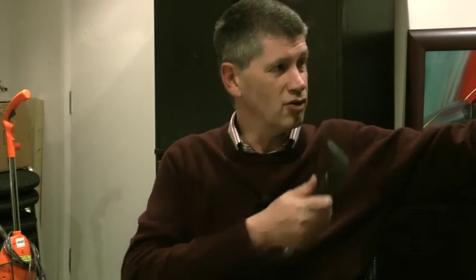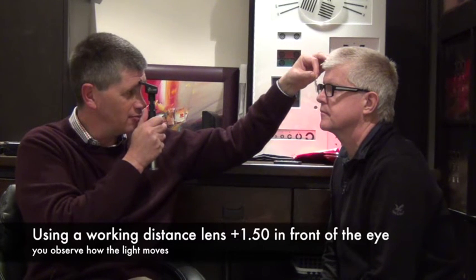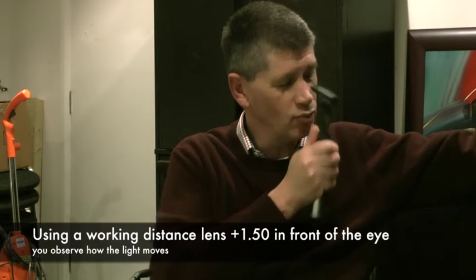To perform retinoscopy, have the patient look past you into the distance with room lights off, then shine the light into their eye and observe how the reflection moves. There are three possible movement types: when you rotate the retinoscope and the light moves the same direction, that's a 'with' movement; opposite direction is 'against' movement; and when there's no clear movement either way, that's called reversal.